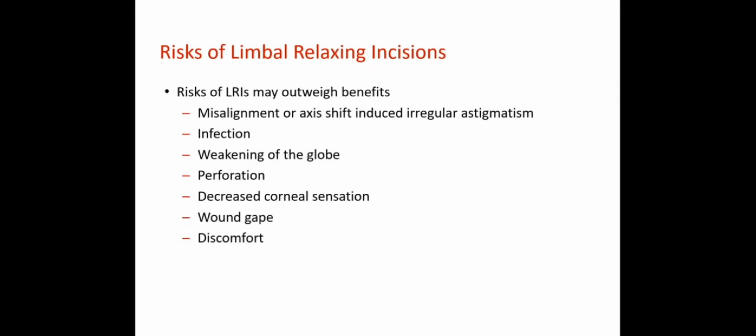Is that right, Hannah? It can, not a huge amount, and I'm not sure if it's actually indicated to do so, but it is being used for it. Okay, yeah. So those are the surgical methods of correcting astigmatism. Of course, toric implantation is another method.